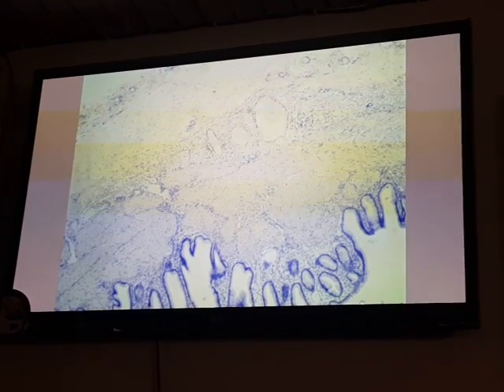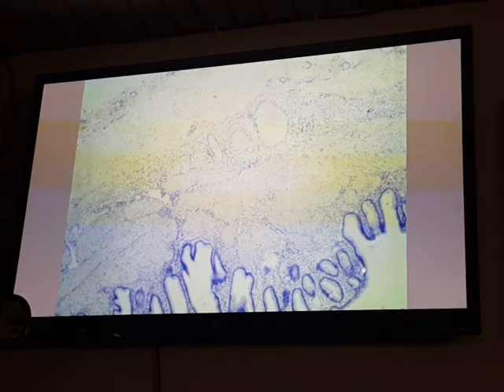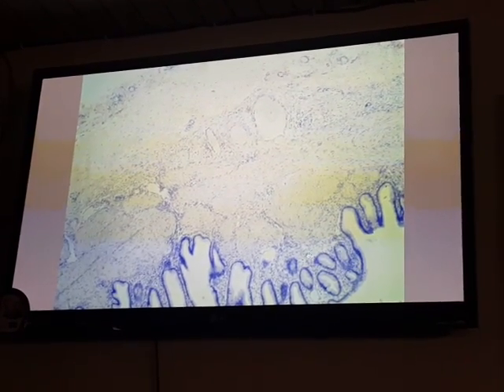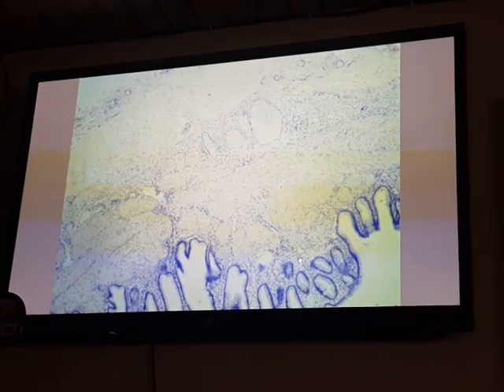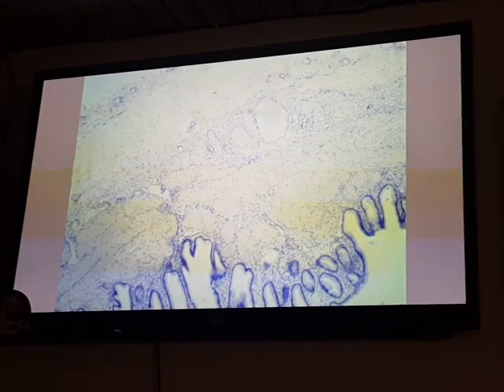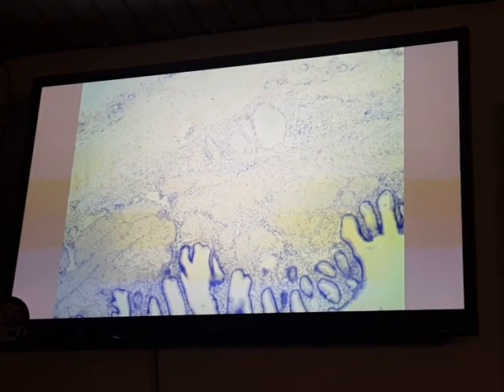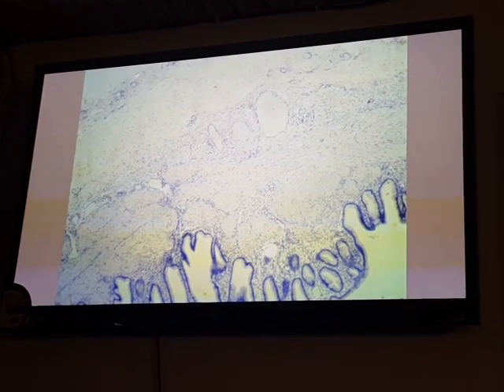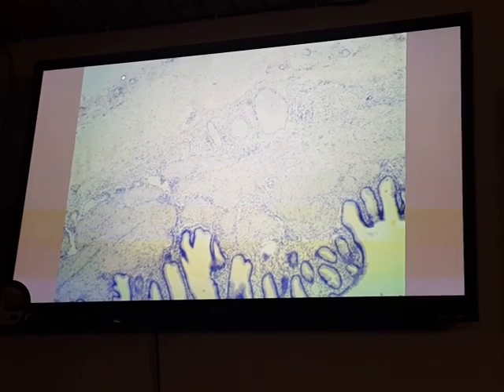What is required for the gallbladder: the mucosa consists of lining epithelium, which is simple columnar epithelium. Beneath we have a lamina propria of connective tissue, a layer of smooth muscle fibers, perimuscular layer of connective tissue, and serosa. This slide is stained with H&E stain.